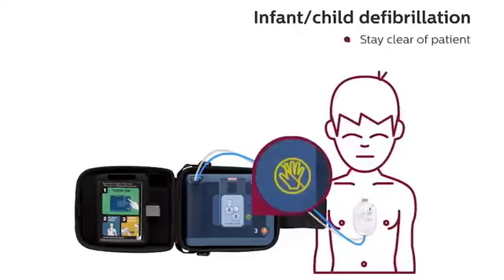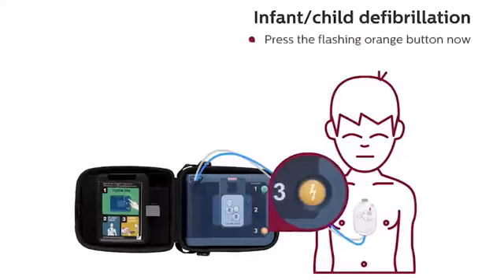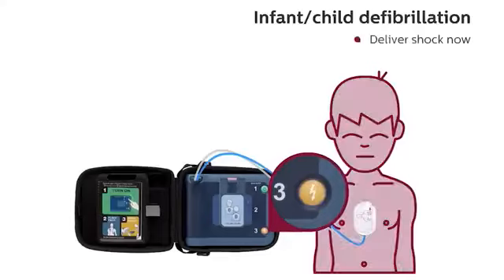Stay clear of patient. Analyzing heart rhythm. Stay clear of patient. Analyzing heart rhythm. Shock advised. Stay clear of patient. Press the flashing orange button now. Deliver shock now.